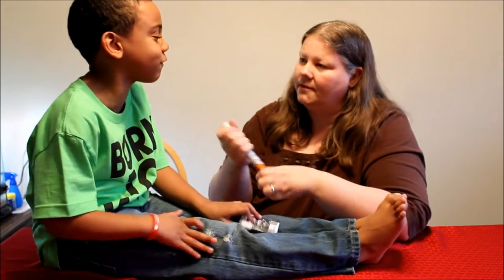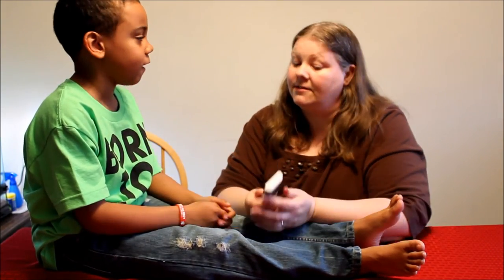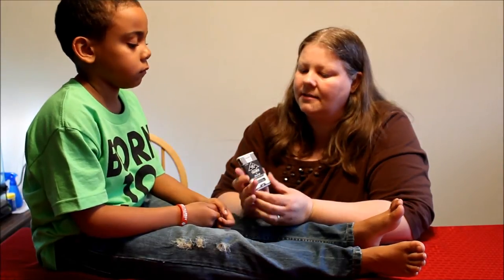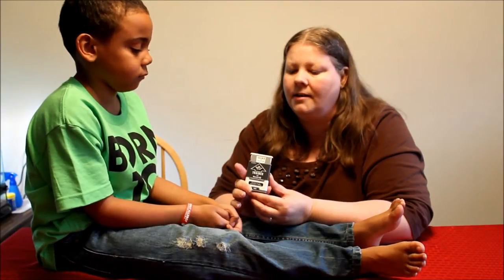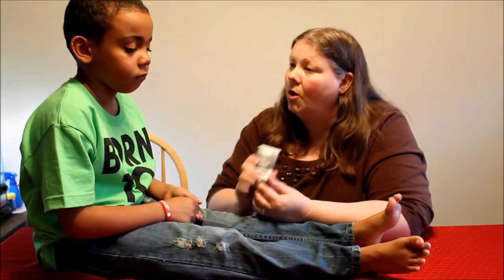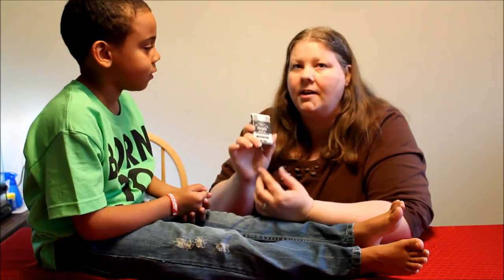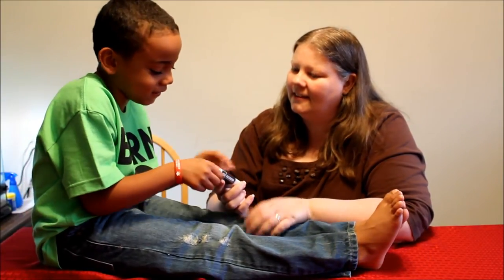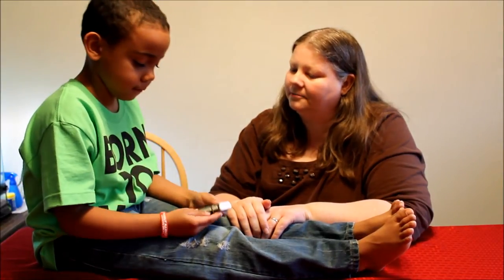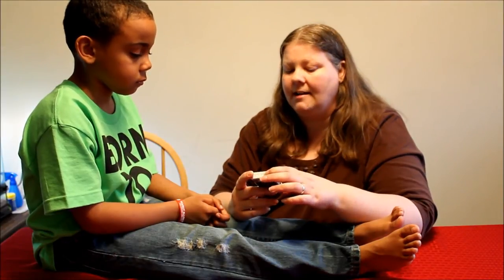Can you try the EpiPen trainer for comparison? It's so different — go ahead. This gives voice instructions to people who may not know how to use an epinephrine injector. And if you already know how to use it, you can go ahead and it will keep up with you. You hold it for five seconds — it's very smart.